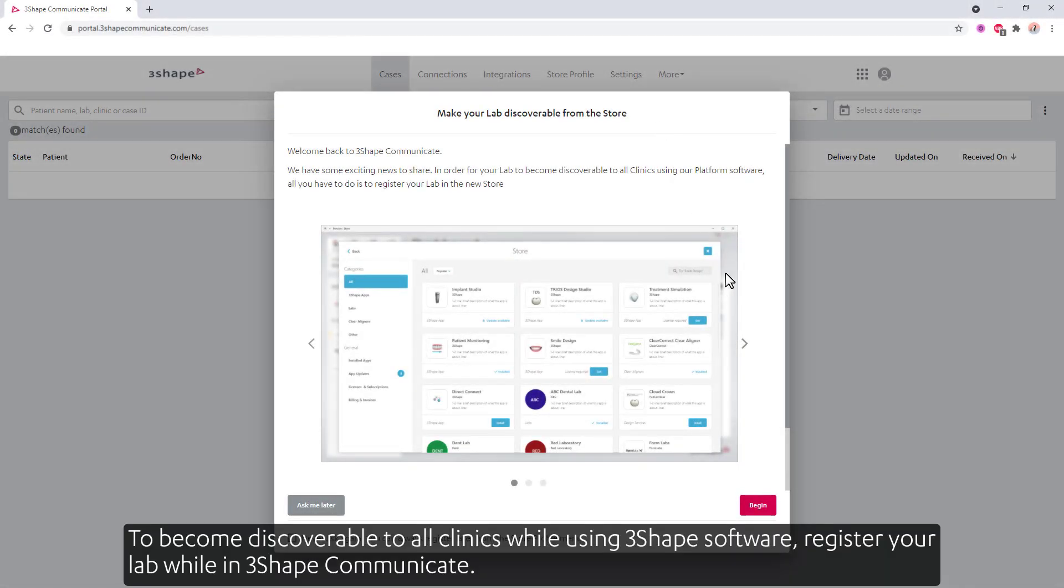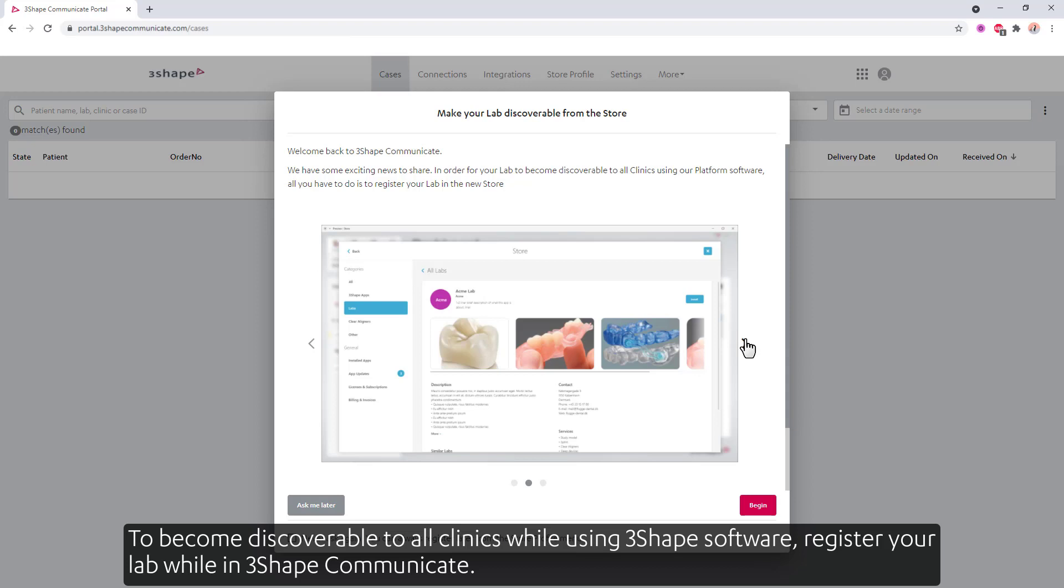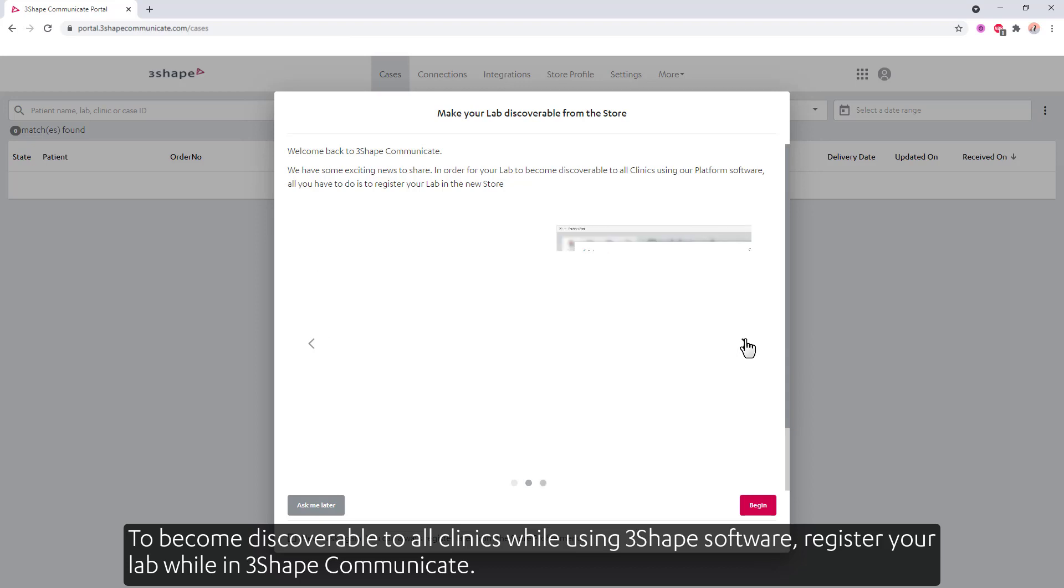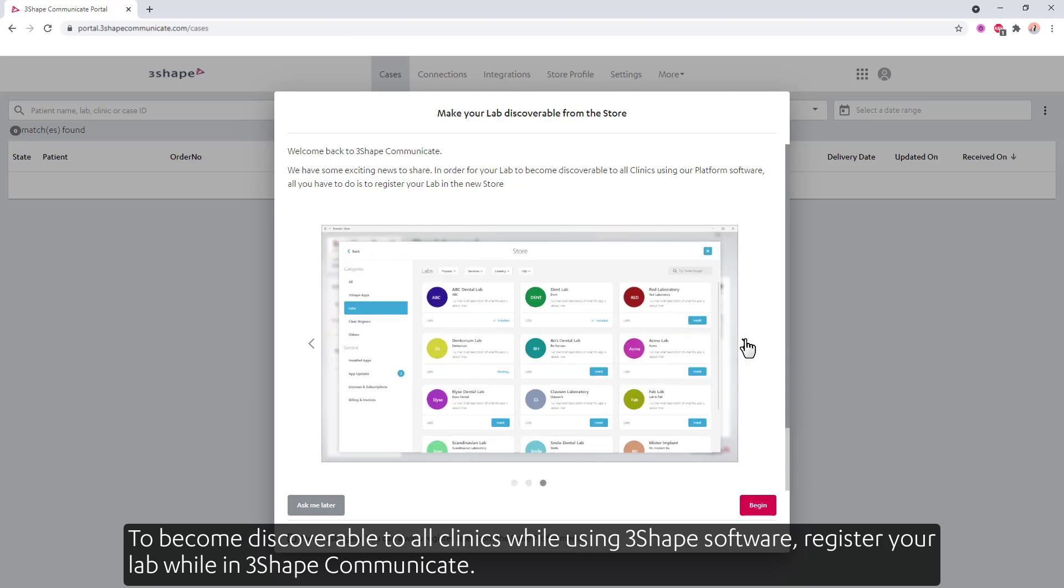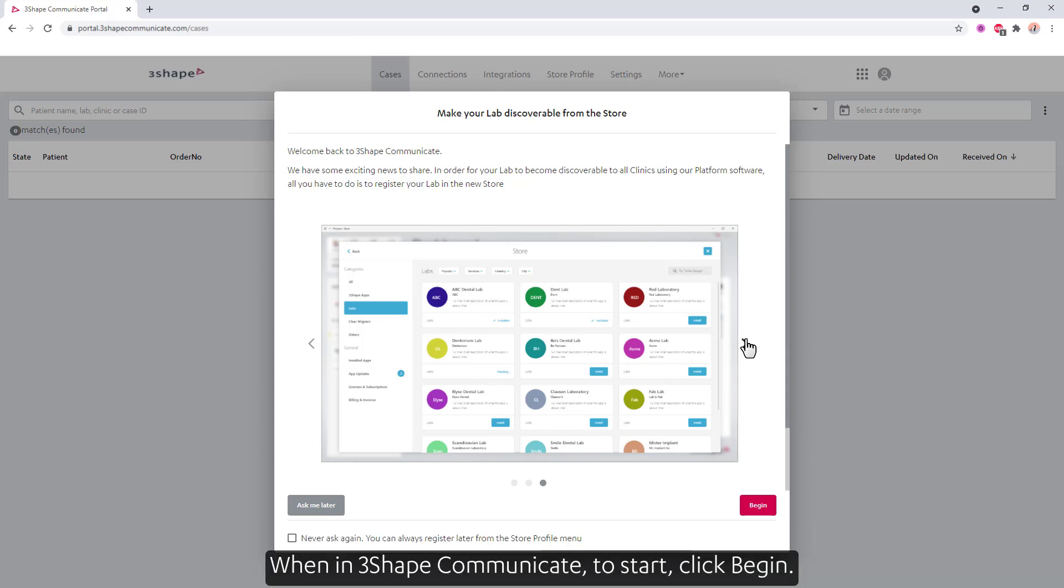To become discoverable to all clinics while using 3Shape software, register your lab while in 3Shape Communicate. The registration is free of charge and takes a few steps, which helps your lab to be visible to clinics in the store.